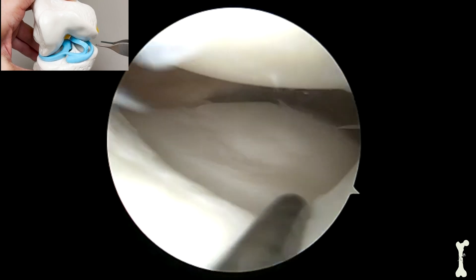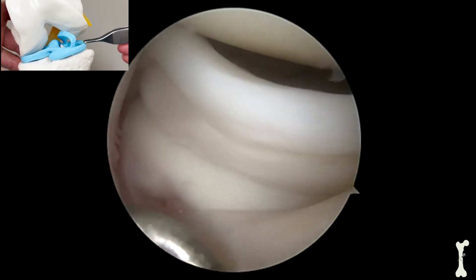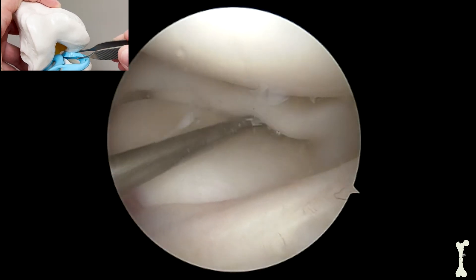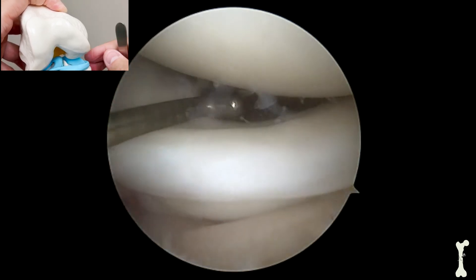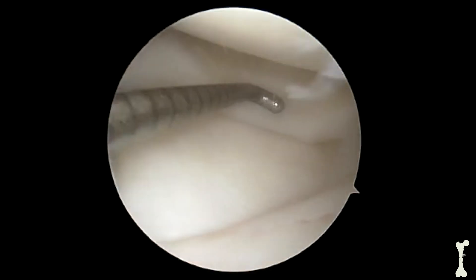This video shows the actual bucket handle tear. You can see how the displaced meniscus tissue is situated between the femur and the tibia. Here I used my arthroscopic probe to push the meniscus back into position, but you can see how unstable this tissue really is just by watching how easily I can pull it in and out of position.